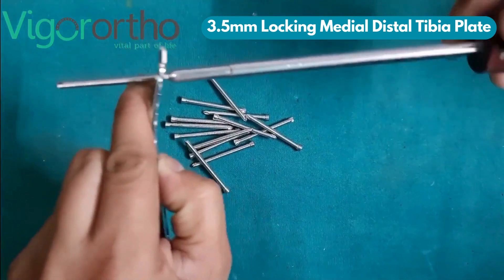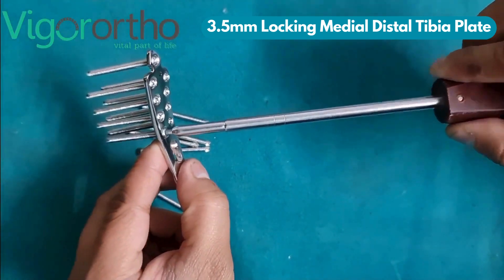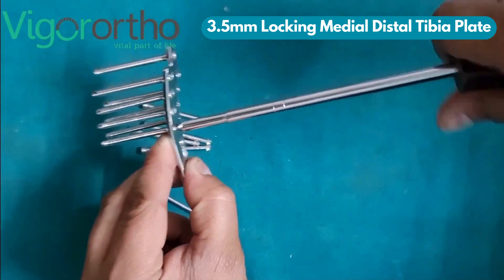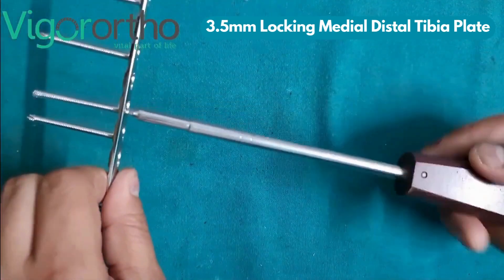It allows for both locking and non-locking screw options, providing flexibility in surgical technique. The plate has threaded and dynamic holes that allow 3.5mm locking and cortical screws to create a stable fixation. Locking screws provide angular stability and prevent screw loosening, making it ideal for osteoporotic bone or complex fractures.